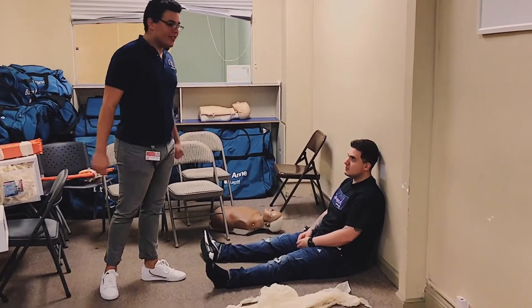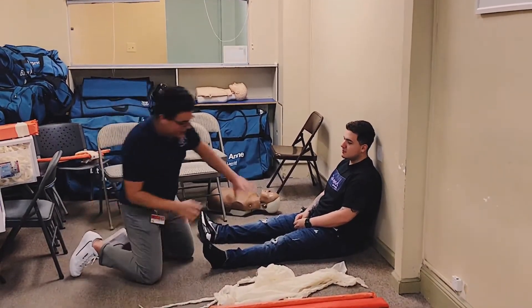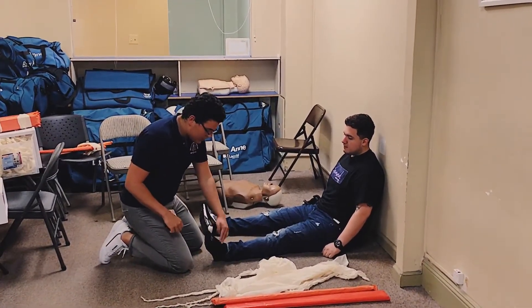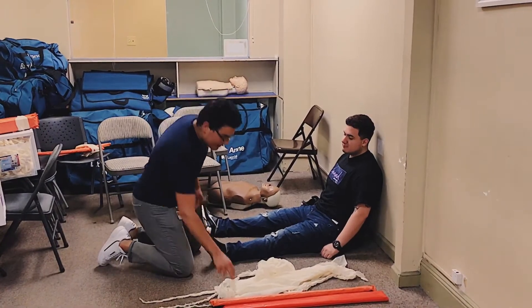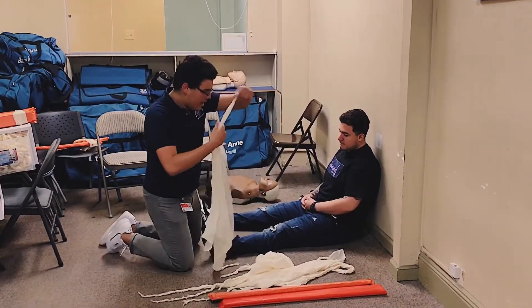We have an isolated injury of the patient's left tib fib. I'm going to have my partner go ahead and stabilize above and below the injury. I'm going to assess for pulse — wiggle your toes — motor, which toe? Big toe. PMS is intact. I'm going to go ahead and lay out my cravats.